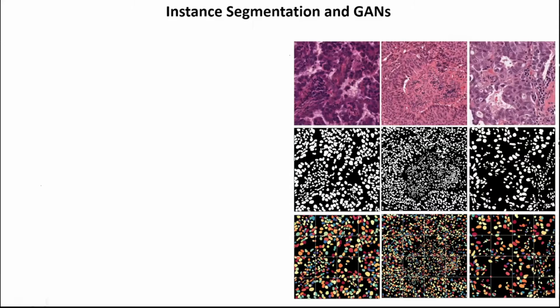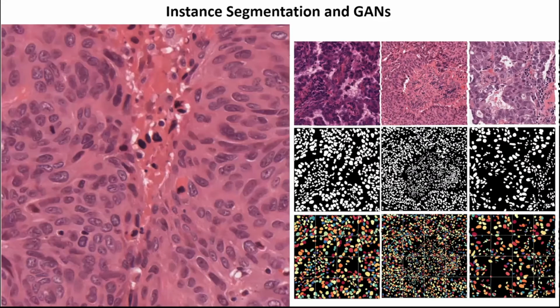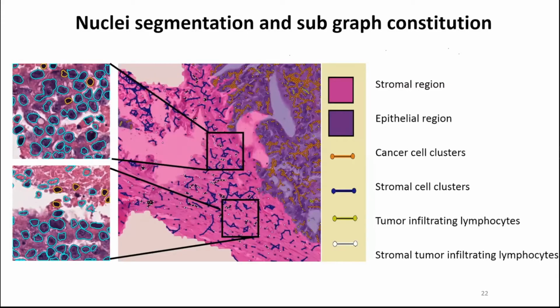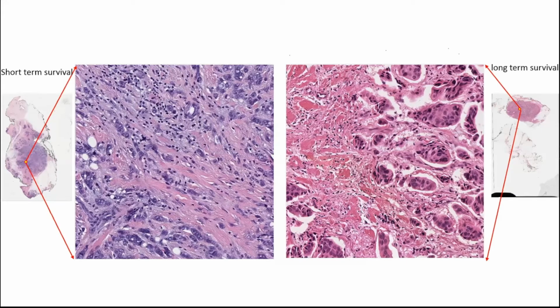The other thing that these networks are really good at is classification of individual cells. You can classify lymphocytes from cancer nuclei. You can look at macrophages, fibroblasts. You can also segment out, like I said, stroma from epithelium, and really look at the organization, the architecture of the different cell types within different tissue compartments, with a net result that we can now start to translate all of this into digital biomarkers that can allow us to predict outcome and predict therapeutic response. So the theme I'm really getting at here is that you've got the opaque representations with deep learning, but the efforts in our group have been more focused around interpretable features, intuitive features, organic features, features that are really connected to the domain or the pathobiology of the disease.